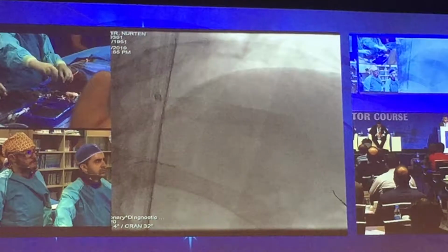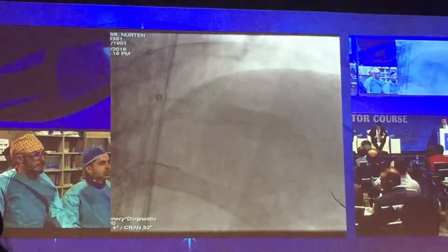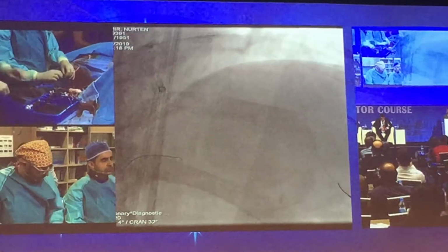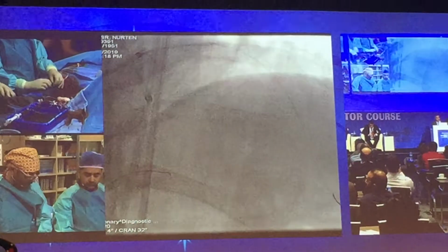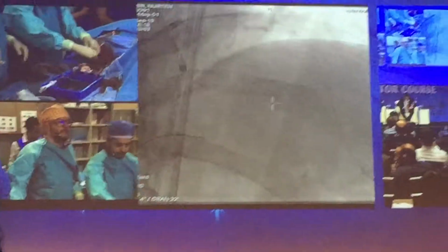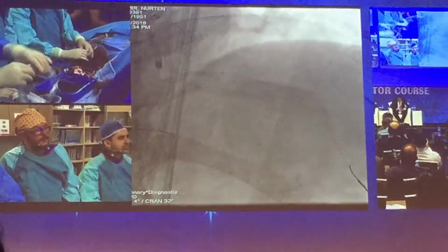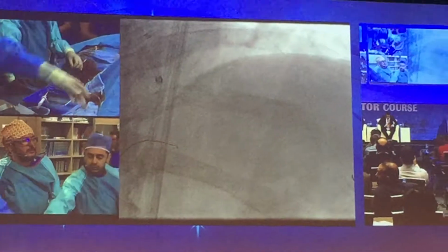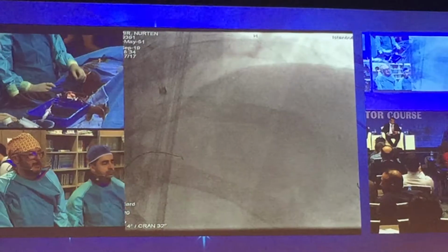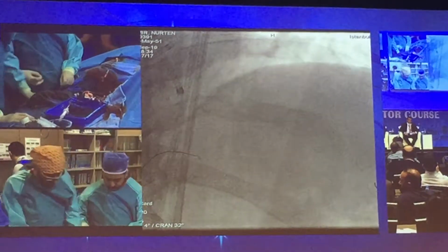Şu teli de al. Trap de al. For a 7 French catheter, which size balloon do you use for trapping this wire? Balon please. Which one will be safe? A 2.0 is enough, or should we use a 2.5 or something like this? It can be done with 2 and with 2.5. You can use either one.